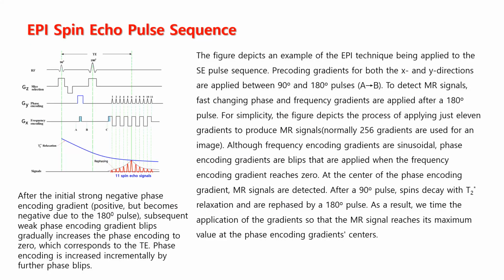First, let's see the EPI technique applied to the spin echo pulse sequence. So, EPI spin echo pulse sequence. The figure depicts an example of the EPI technique being applied to the spin echo pulse sequence.